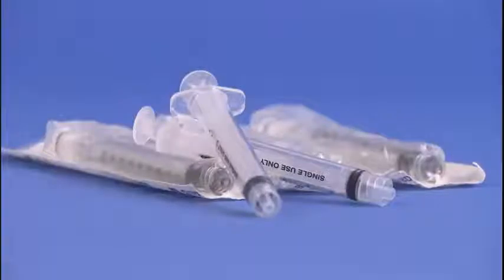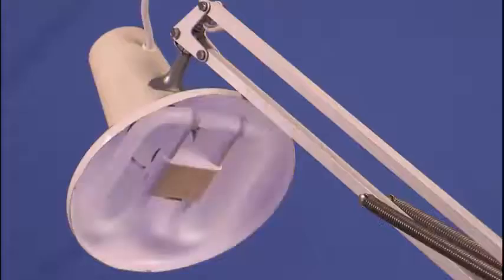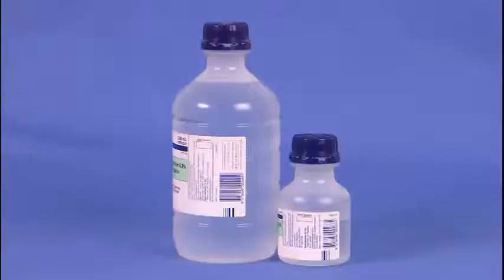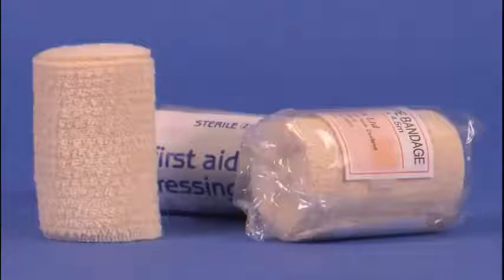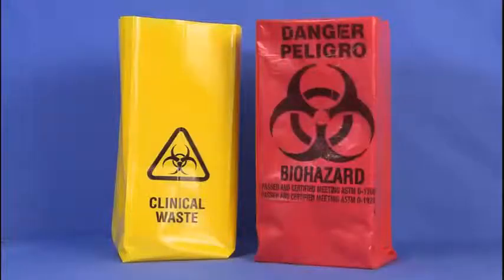medium, a syringe, and a container for wound aspiration as needed, an examination light, sterile gauze squares, wound cleaning solution, dressing, a transport bag, gloves, biohazard bags.